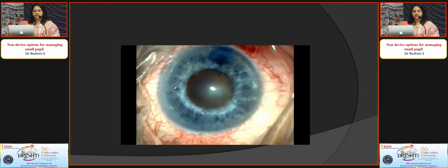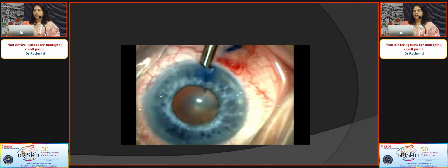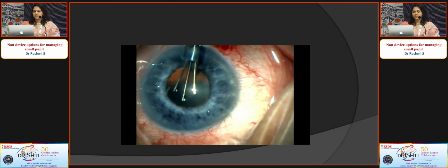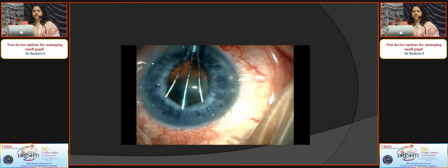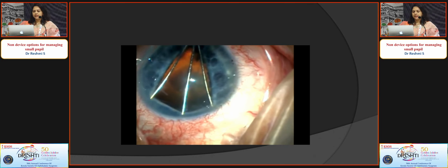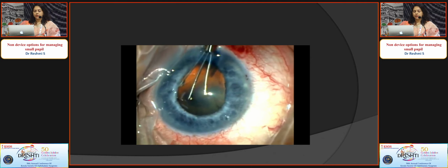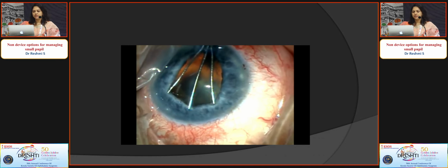Here, the Beehler device is inserted through the main incision. The first hook wraps around the subincisional pupillary margin and then upon pushing the plunger, 3 more hooks emerge. They hook the distal pupillary margin. So, in one stretch, the entire pupil becomes dilated. The Beehler pupil dilator distributes the tension uniformly throughout the pupillary area so that it will not produce any pupillary deformities. Patient will have a better cosmetic effect after the surgery.